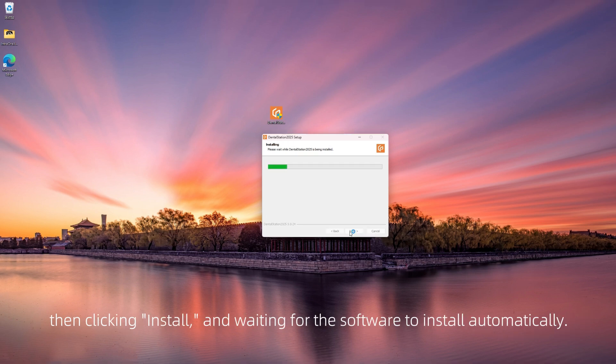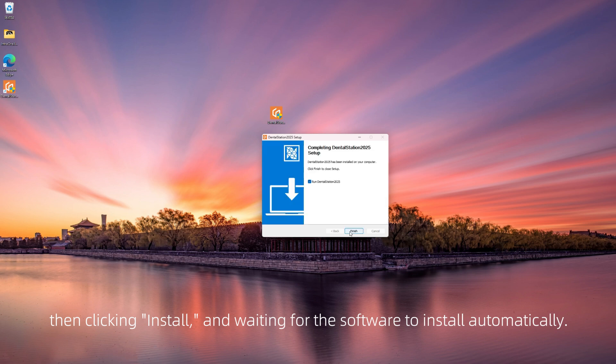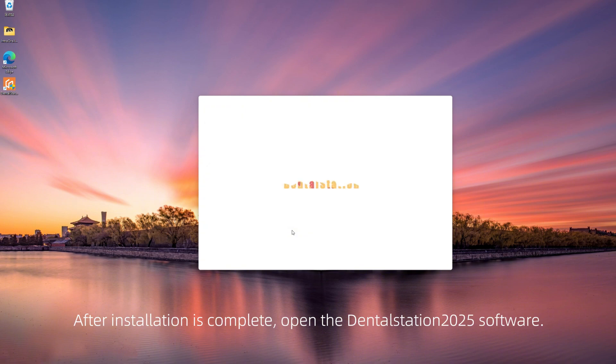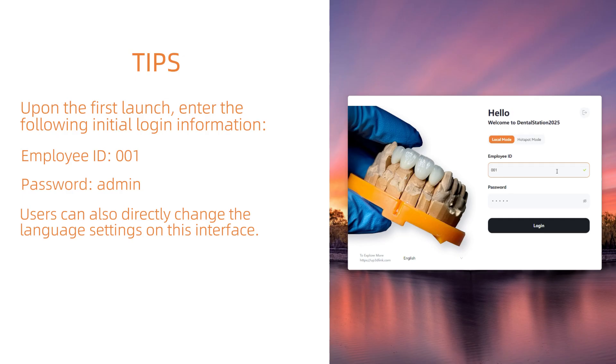Then click Install and wait for the software to install automatically. After installation is complete, open the Dental Station 2025 software.